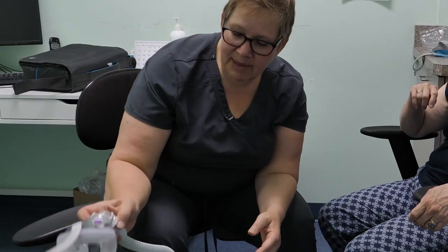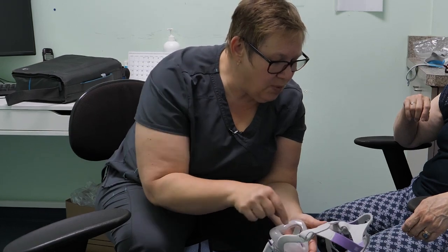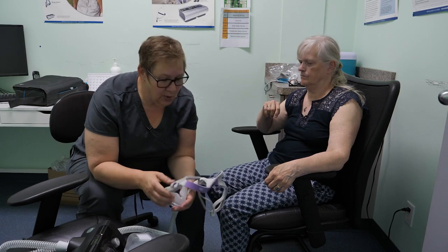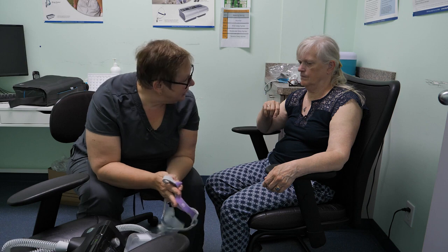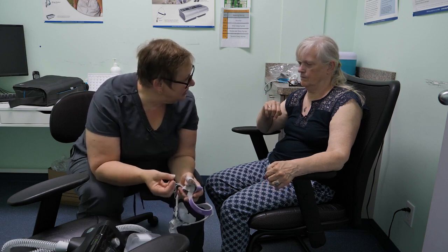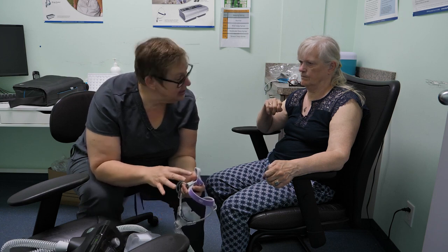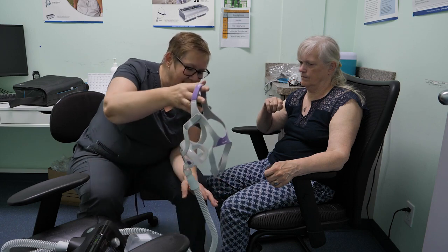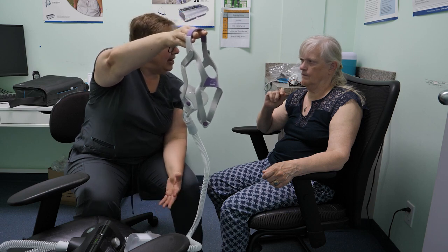You're also going to take the mask. You're going to make sure that you're washing the inside of it. Be very, very gentle when you're washing the cushion, because if you're too aggressive, you can tear the silicone. The headgear, I want you to take it as well, and scrub it together and make sure that you are washing out all the oils and the dry skin cells. Okay. Once you have washed everything, I want you to rinse it really well with clear water. And then you're going to take the mask and the hose just like this, and hang it up from the shower head and let it dry.